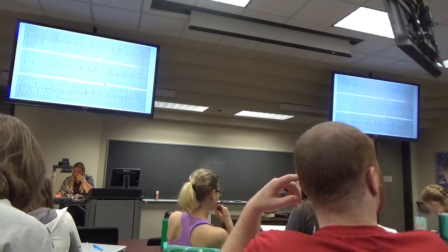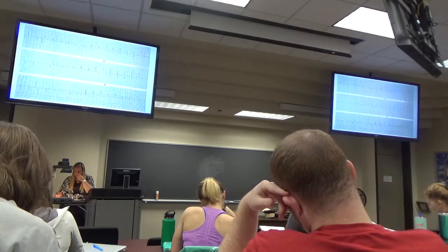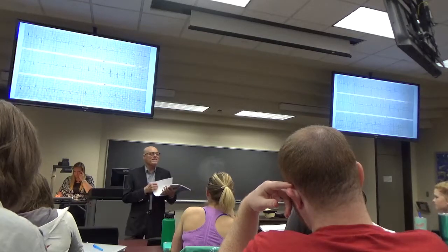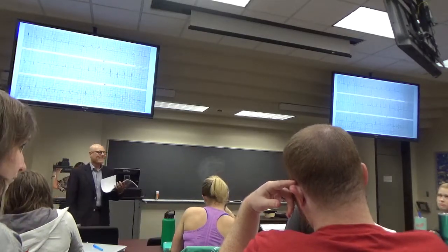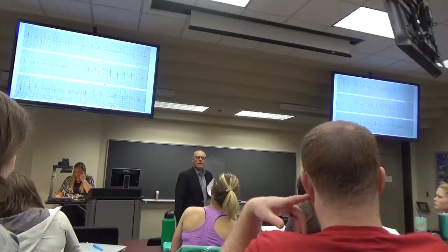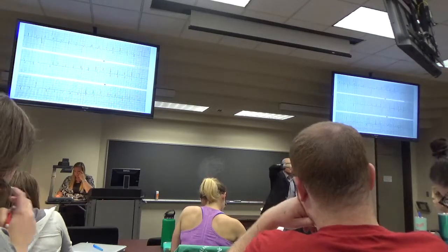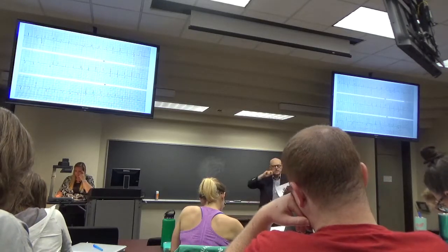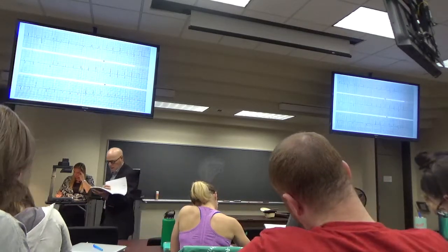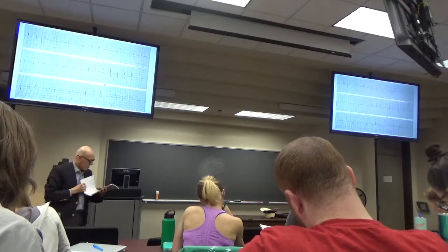Okay. Any other questions? What about these T waves in V1, 2, and 3? How many call them ischemia? What do the rest of you call them? Right, bundle branch block. They're appropriate for the bundle branch block. The T waves need to be opposite the last portion of the QRS. So V1, 2, and 3 are appropriate. V4 is a little inappropriate. Well, maybe not. No, it's okay. I got it now.